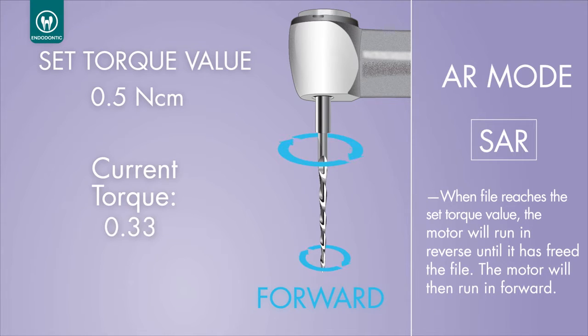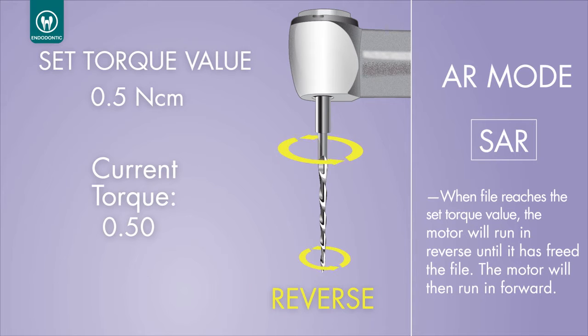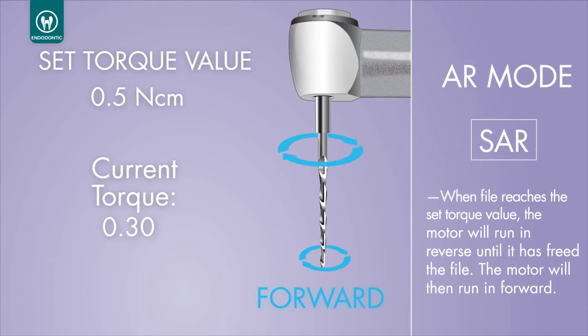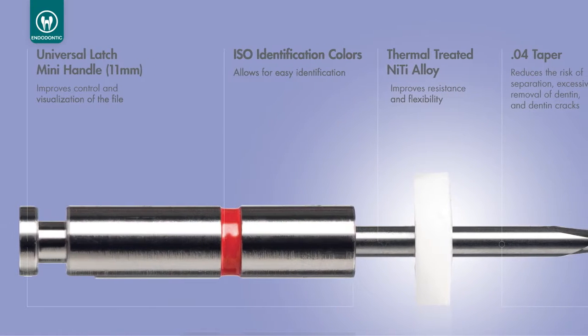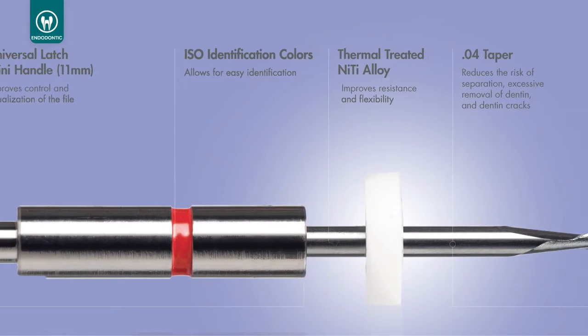That is a kind of feature that when you press special auto reverse, when the file reaches the torque, the file will stop, start some reciprocation until the point that you release the file, and then goes in rotation as well. So the Genius files are designed to be used in reciprocation and rotation.